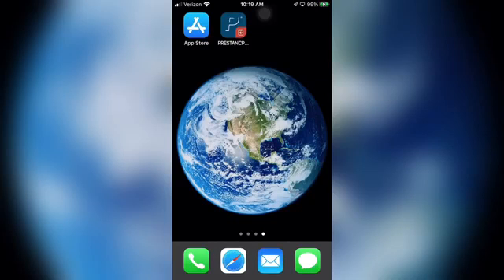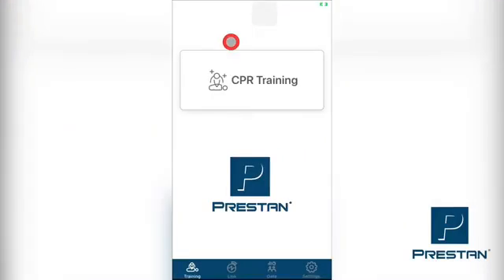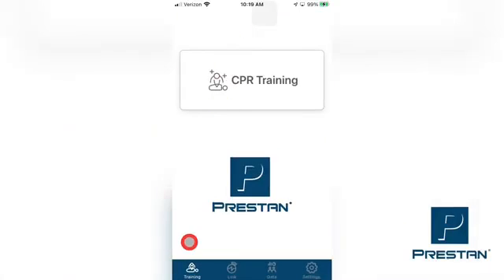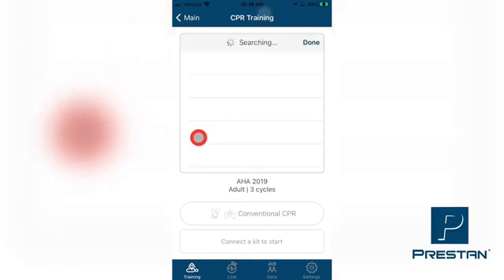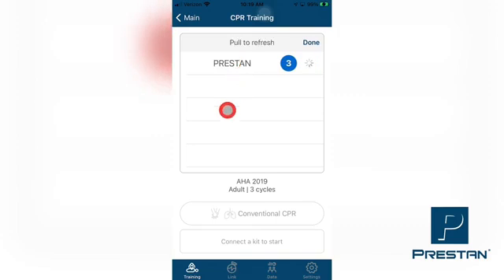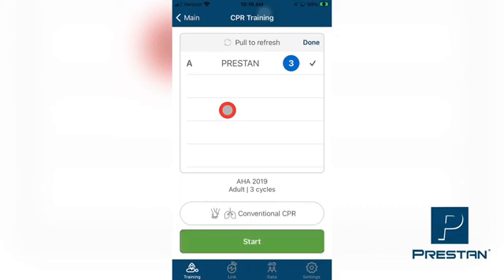The Preston CPR Feedback App gives you the ability to temporarily assign a student's name to the mannequin for a training session. Select the Training tab at the bottom of the screen, then press CPR Training. On the next screen, press Connect Kit. Select any mannequins to connect from the list that appears. Once connected, a checkmark will appear on the line with the mannequin name. When all mannequins have been connected, press Done at the top right corner of the screen.